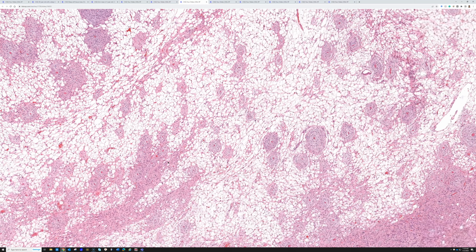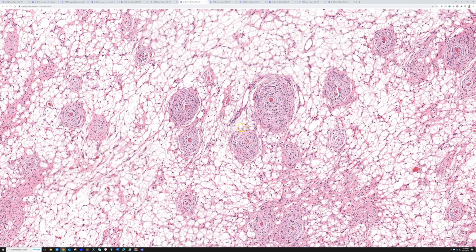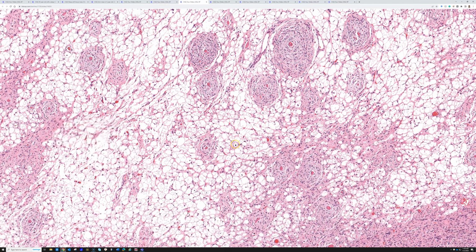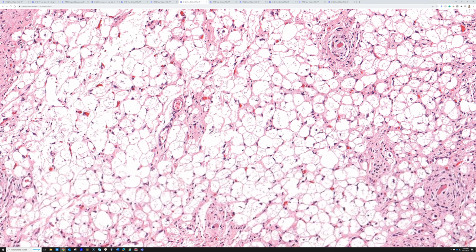I have never seen this particular pattern in a dedifferentiated liposarcoma before. I just thought it was fascinating, and I have been saving this up to share at some point in the future, because it was kind of a special case, and I wanted to share it with all of you. And what's more, look at the background. For some reason, you get all of these kind of bland, multivacuolated lipoblasts filling the background space, almost resembling the pattern of brown fat that you see in hibernoma. So what a bizarre, crazy tumor with so many different patterns.